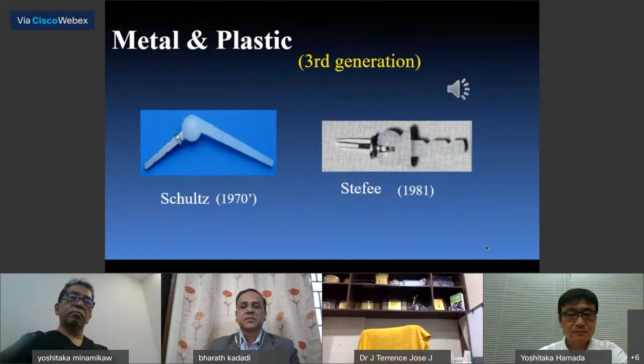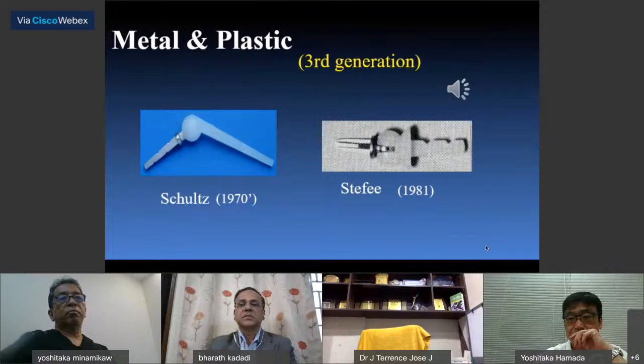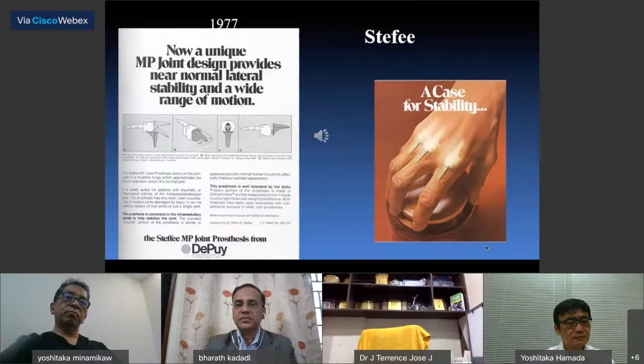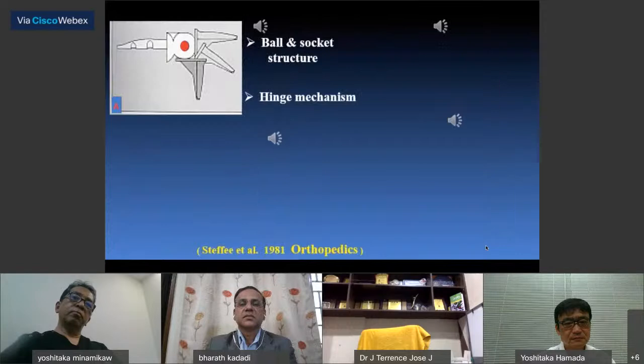Following the success of total hip arthroplasty, many metal and plastic implants were produced. Steffee's implant was on the market, as shown in the ads in the Journal of Hand Surgery in 1977. This implant was filled with the knowledge and experience of the doctors in the Mayo Hand Group. Steffee's implant was a metal and plastic implant designed for the MP joint.